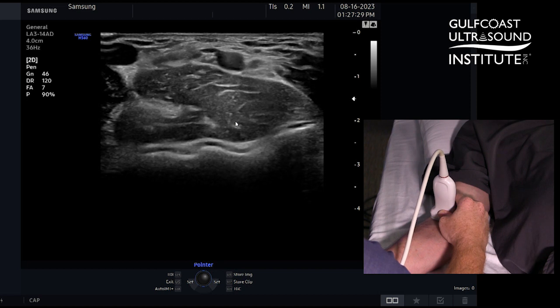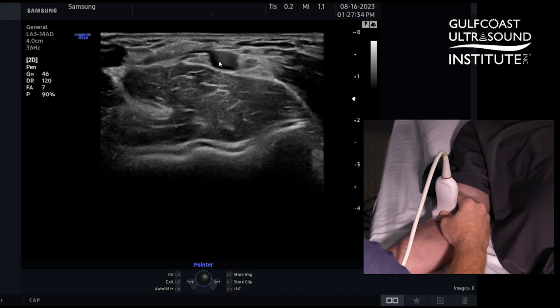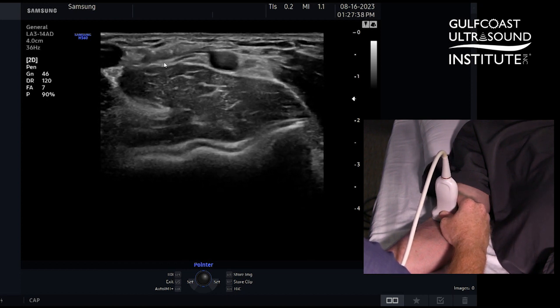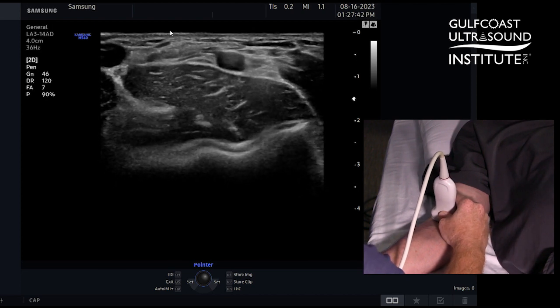Alright, here's a little anatomy review. This is the brachialis muscle here. Here is the brachial artery, and next to that is the biceps brachii tendon. So when we see it in this view, we're short axis at the forearm.